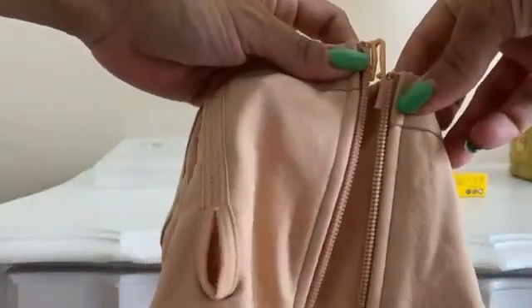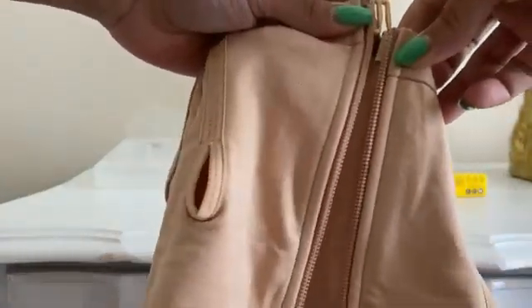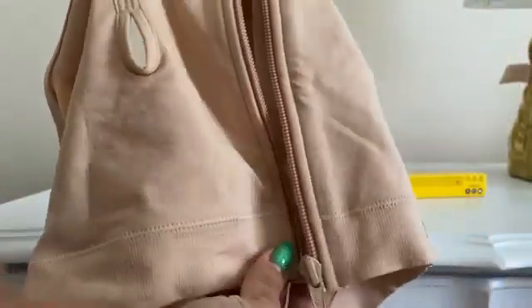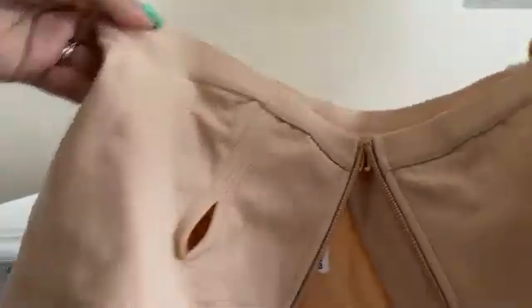Very easy to just put it on. You can see right here, and then you would just zip it right here on the bottom. But this is pretty much it — pretty comfortable — and this is in the size large.